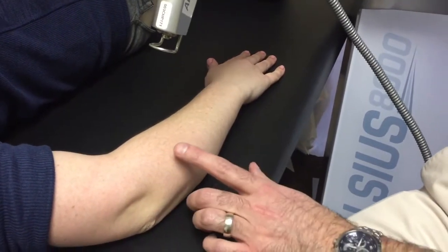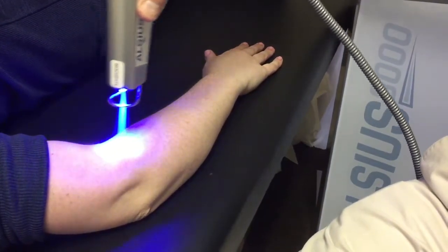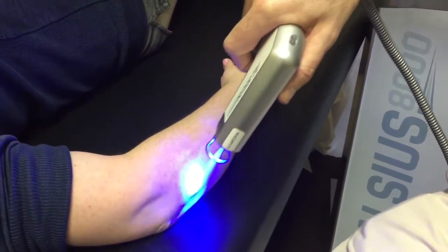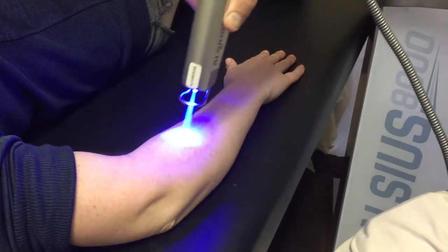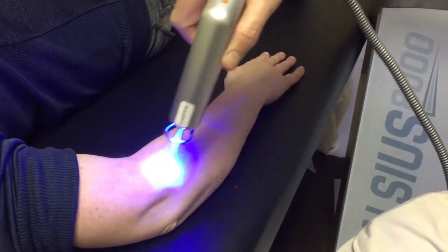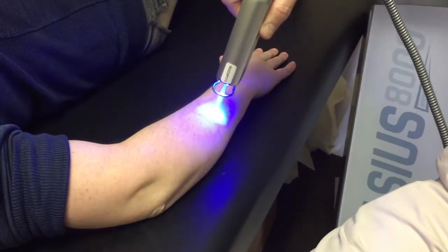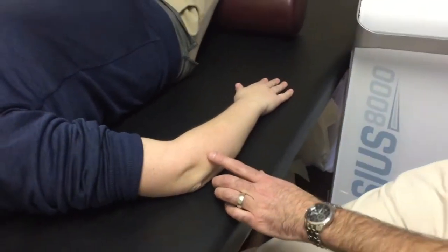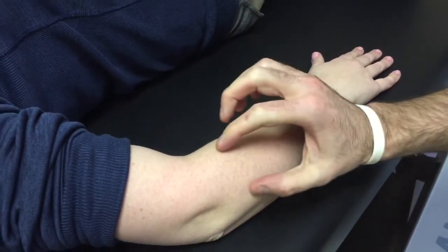As the tissue starts to get cold, the gun will shut off as a safety mechanism, so we can just keep going. We do a total of two minutes on treatment. You'll notice there's hardly any redness or anything to the skin, and what it does is just reduce the inflammation on the actual elbow that we're treating here.